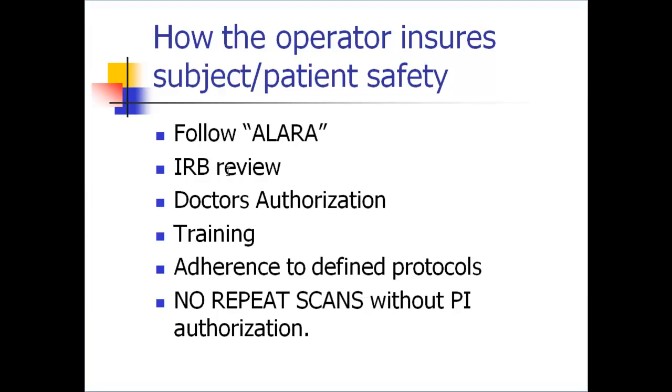So as long as that informed consent document doesn't have a date that's expired, then we're allowed to go ahead and scan that subject. And those documents for all studies that would have a component of DXA would be in the filing cabinet under the folder that says IRB reviews or informed consent.